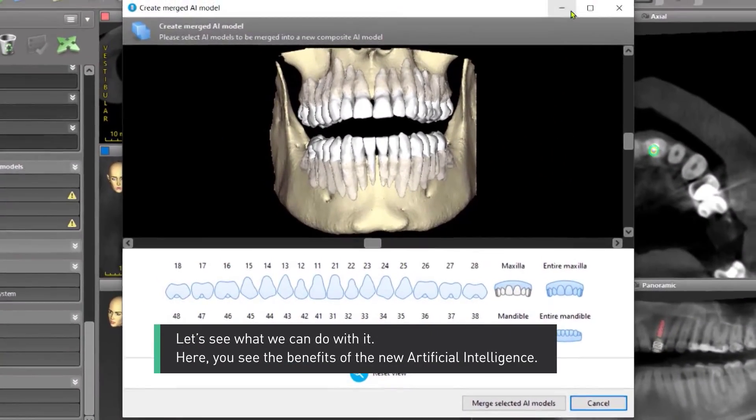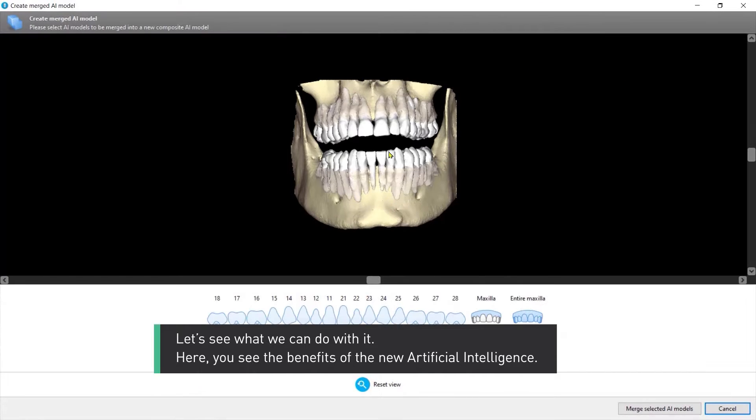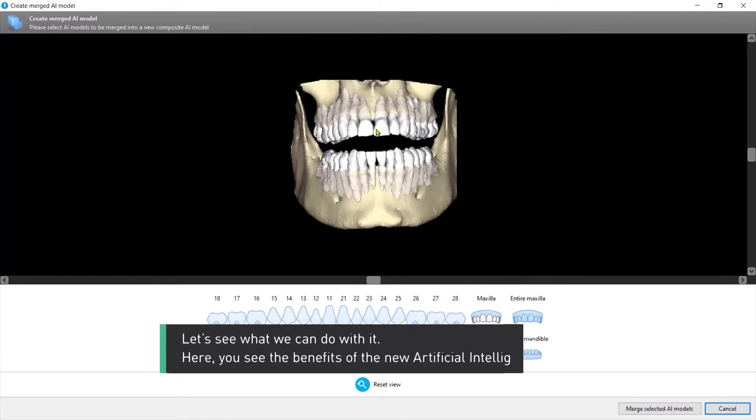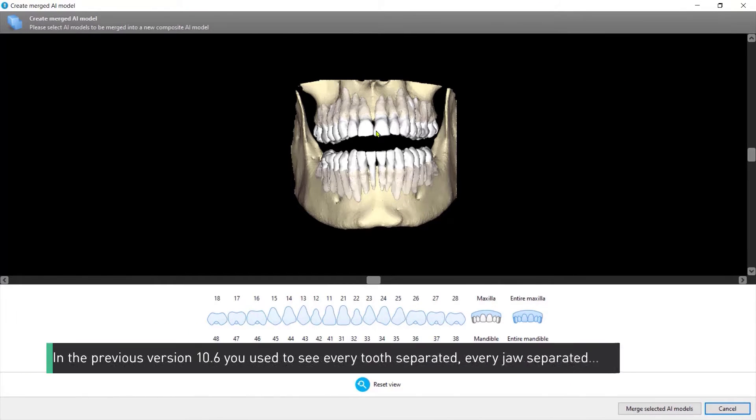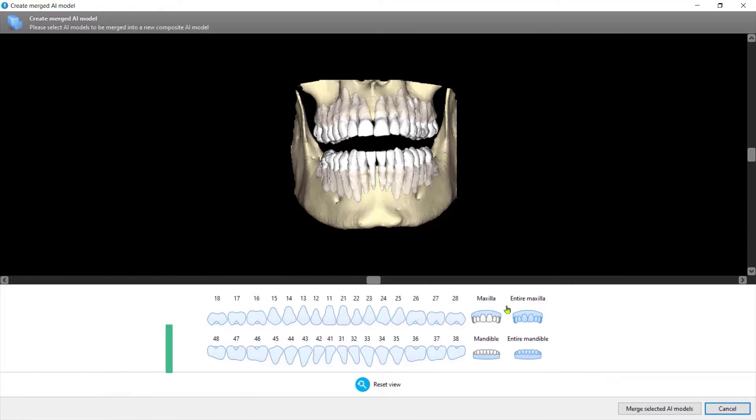Here you see the benefits of the new artificial intelligence. In the previous version 10.6 you used to see every tooth separated, every jaw separated.